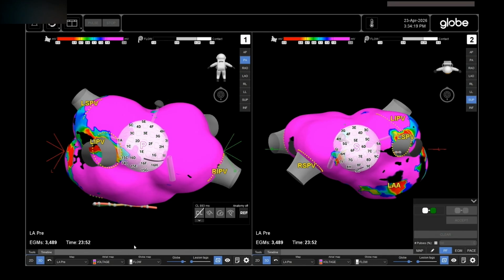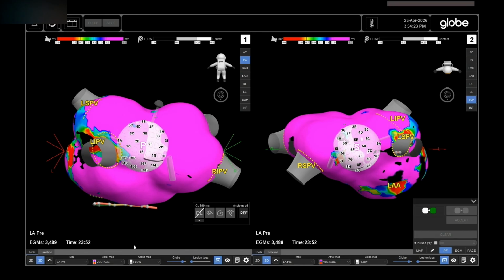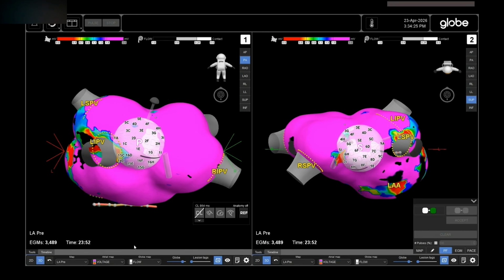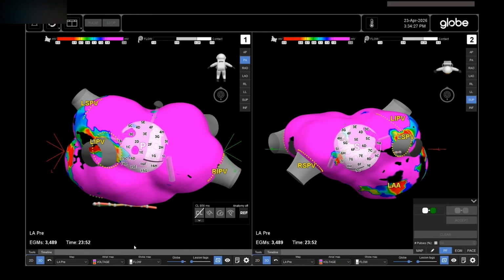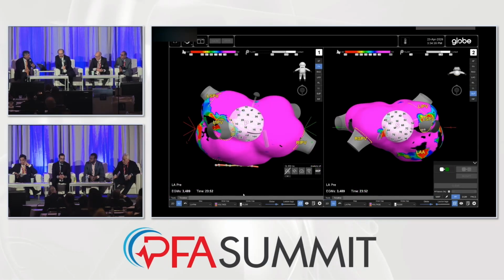And one thing I should note, just really quickly, Srini, let me just point out that this mapping is not magnetic localization. It's based on electrical impedance localization. So as the device is being maneuvered in the chamber, there is some bulging. Part of the bulging is real because as you push against tissue, you deform it. And part of it is, frankly, the deformations that occur in the electrical field. Okay, Srini, please go ahead.